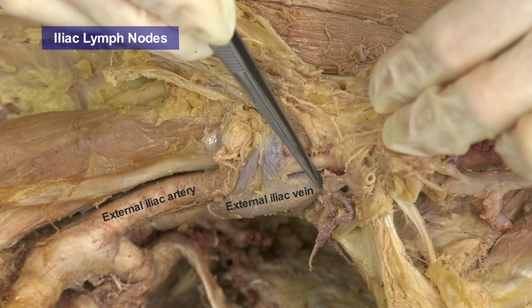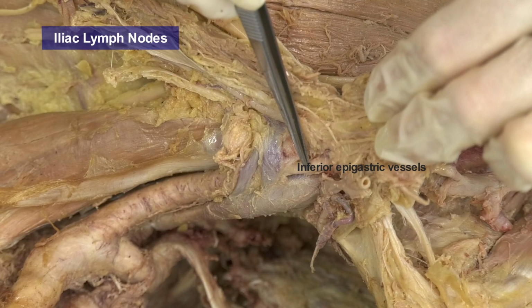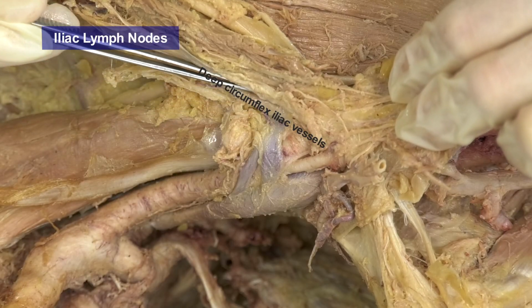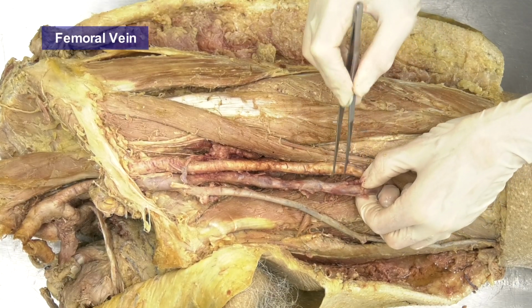external iliac artery. No debranching of the inferior epigastric vein together with the inferior epigastric artery. Going cranially, we see the junction with the deep circumflex iliac vein and artery. Firstly, we will focus on the femoral vein.